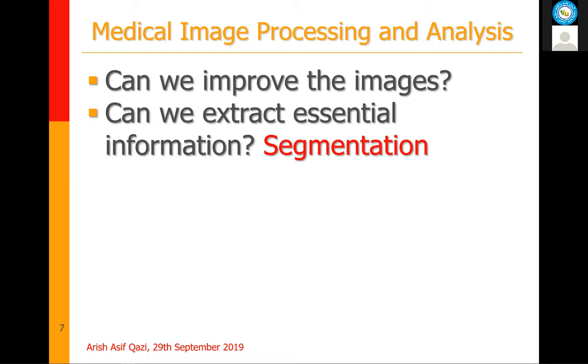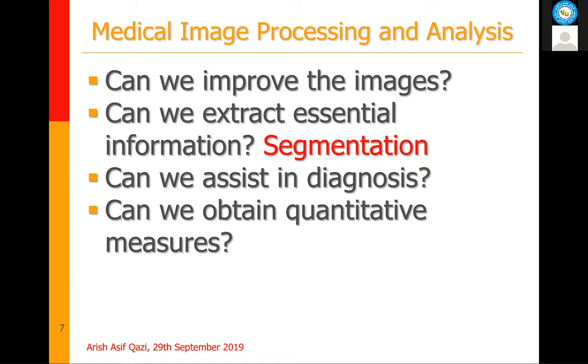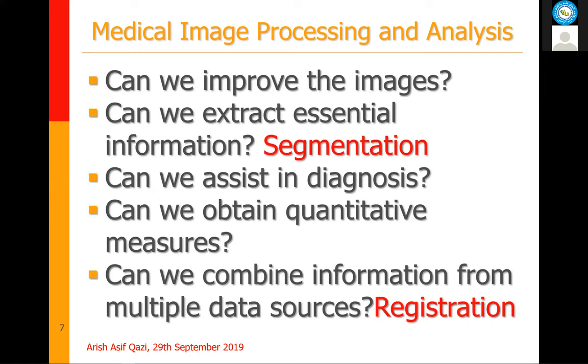Can we assist in diagnosis, also called computer-aided diagnosis, such as divide the image and highlight regions which are cancerous? Can we obtain quantitative measures? Can we develop methods that can tell me the size or the volume of the tumor? Can we combine information from multiple data sources?